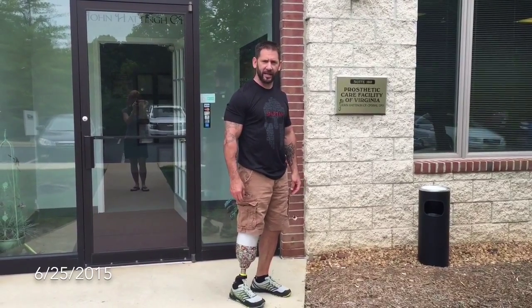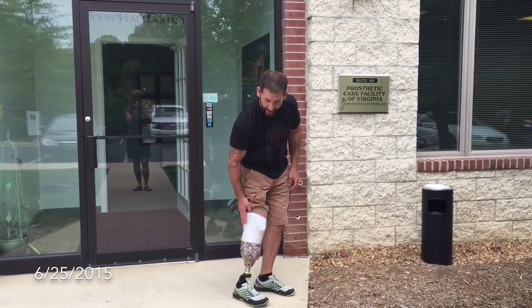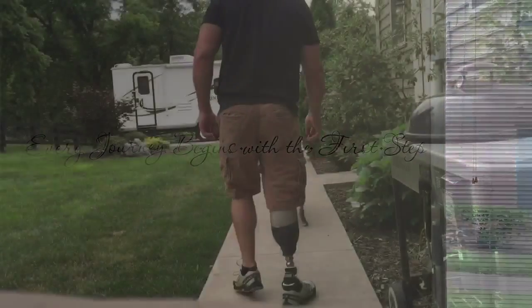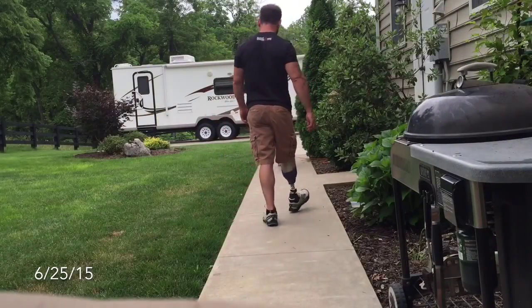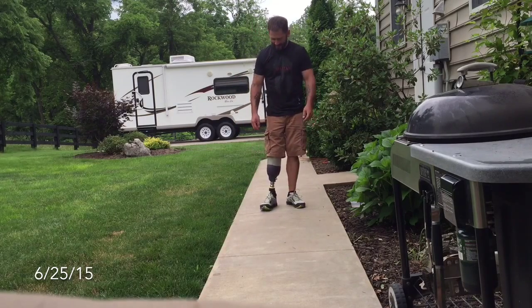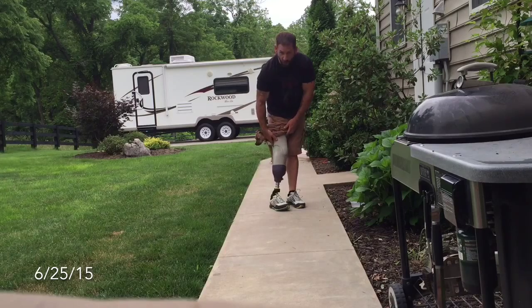Day number two. Here to pick up the second leg, get rid of this big bad boy, and get the smaller one. I got my second socket today — it's a lot smaller.